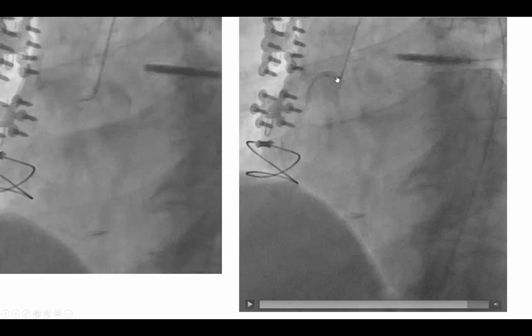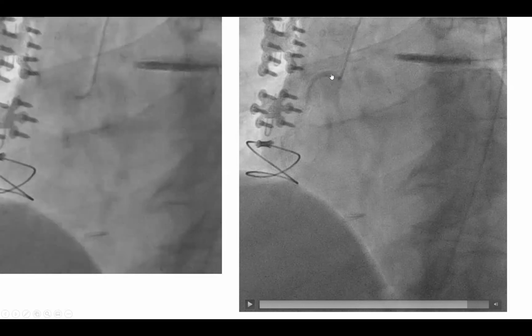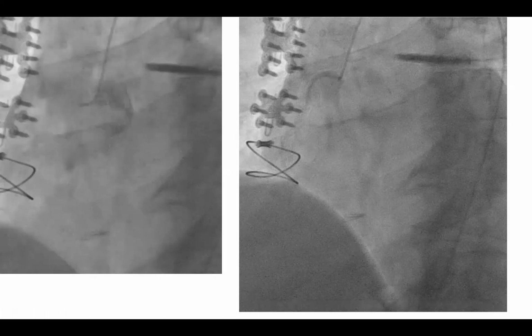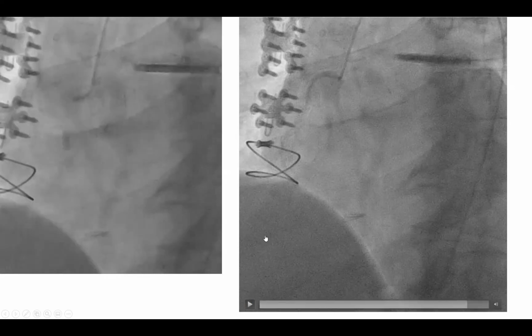So in the right coronary, when you want to get deeper, when the catheter is looking at you and it's not coaxial with the artery, you can clock it here, and the catheter will become more coaxial and more stable. So a lot of times to get a better, deeper engagement of a right coronary catheter, even if you're in, but you want to get better in, you can do further clock to get more deep-seated and more coaxial and more stable in that artery. Okay.